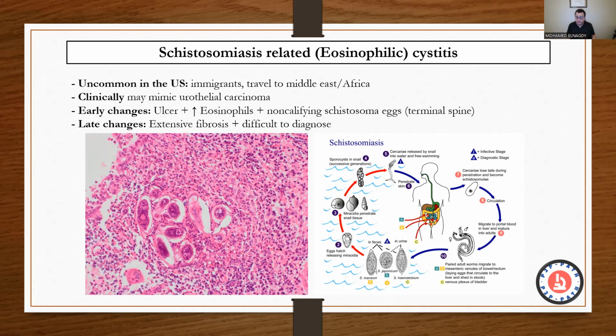The lining is inflamed. And then we took a biopsy, and here is how it looks under the microscope. You see a lot of crowded eosinophils everywhere. A lot of eosinophils. All of these are mainly eosinophilic inflammation.